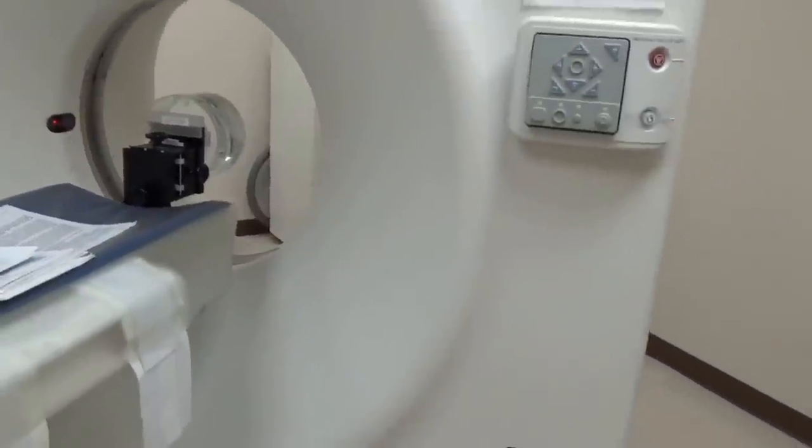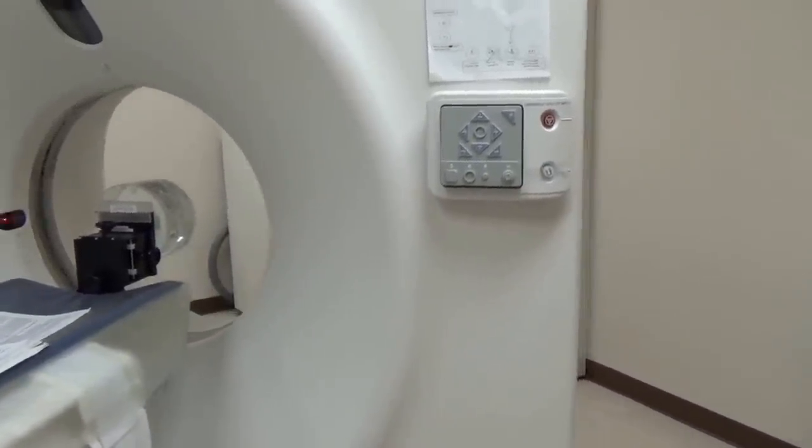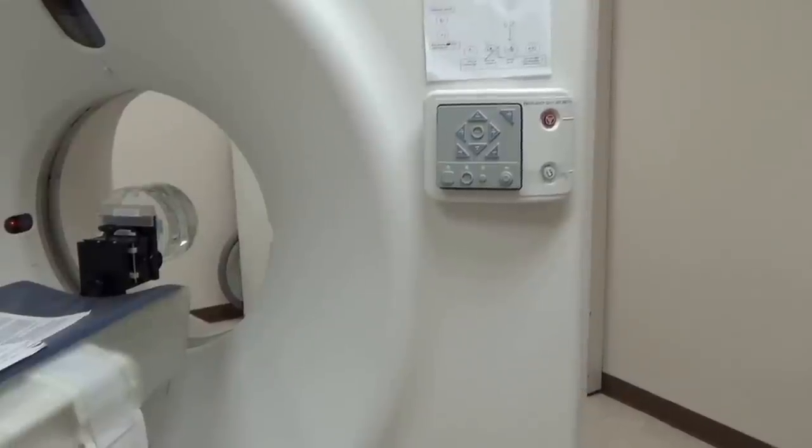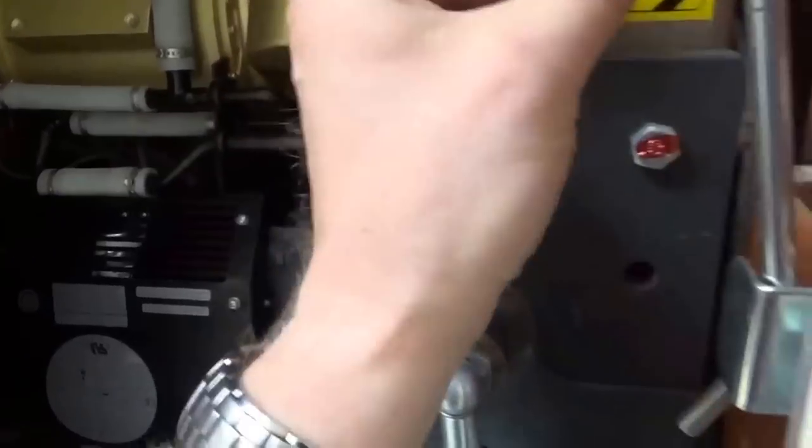We're going to take this apart. We're going to do some work on it today, and we'll go a little bit about what's inside and how it works. So, this is the inside of the gantry, and I just have the side cover off.